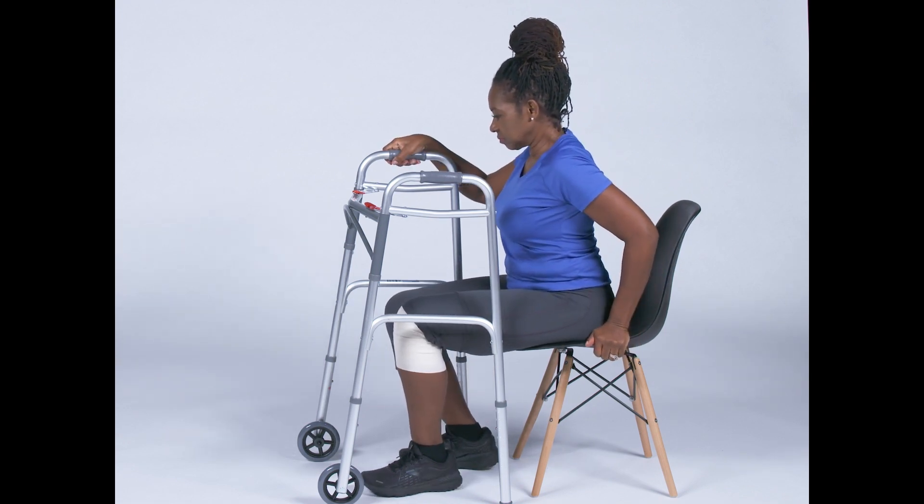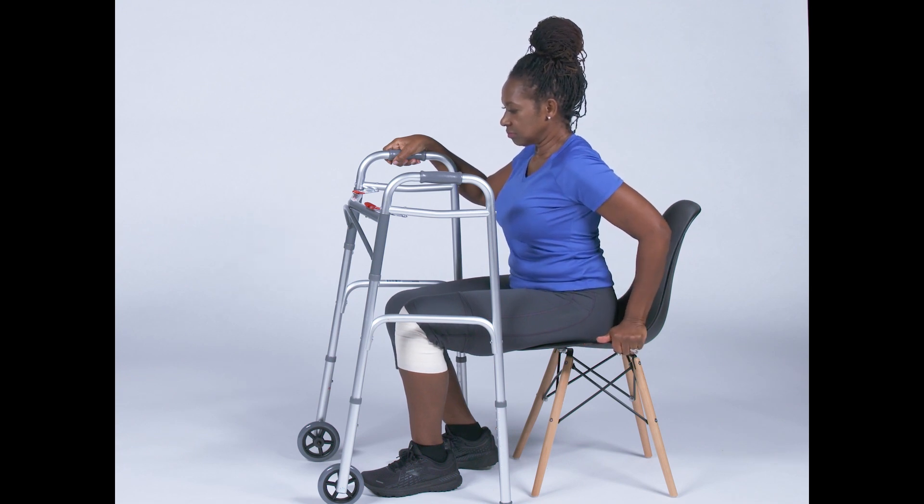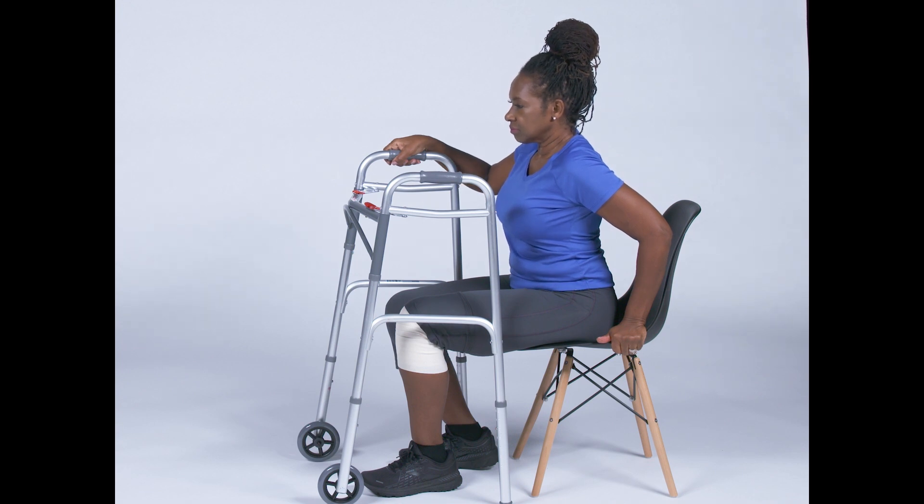Now place one hand on the walker for stability. You will not use this hand to pull on the walker. Place your other hand on the edge of the seat or on the armrest of the chair — you will use this hand to push you up out of the chair.